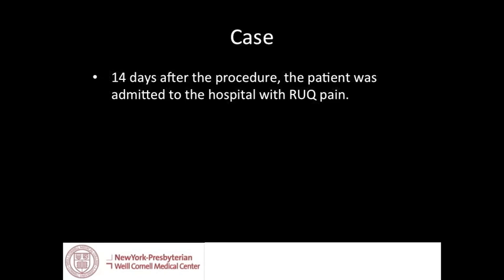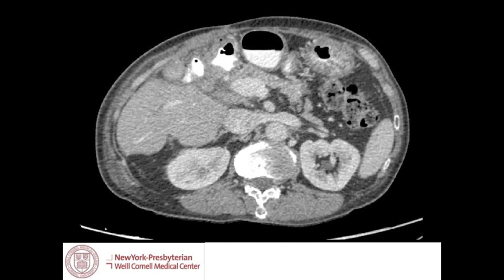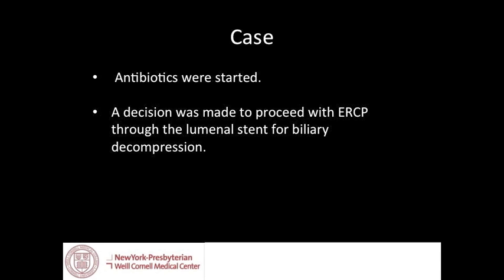14 days after the procedure, the patient was admitted to the hospital with right upper quadrant pain. Imaging showed development of an abscess extending from the bile duct through the subcutaneous tissue and eroding through the skin along the tract of a previously placed percutaneous biliary drain 4 years prior. Antibiotics were started and a decision was made to proceed with ERCP through the luminal stent for biliary decompression.